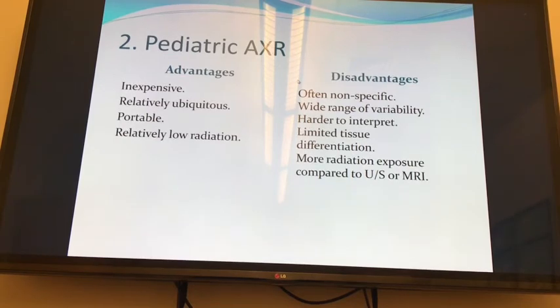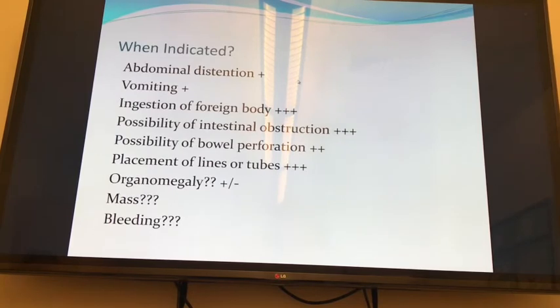Tracy and I were looking at, and usually I like the A and P X-rays. This was a P and A, reversed, and it looked like the ribs were broken, but they're all symmetrical, so we know it's not. It was just the way that it viewed it, not looking at X-rays that much. So we said, you know what, we have to send this and just make sure medical control is fine with this X-ray.